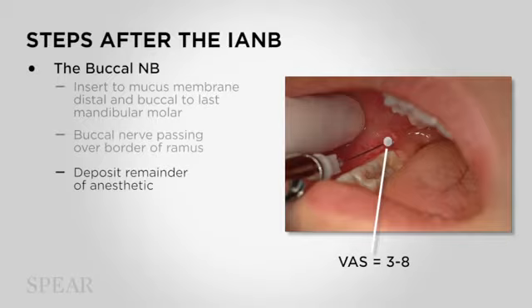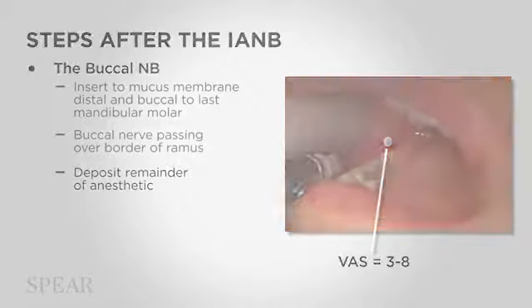And the problem with this injection is the moment your needle enters into the soft tissue, you're on periosteum, and periosteum is very sensitive. You can put topical on to make the needle puncture painless, but there's really no magic answer to making this injection painless, because if you start injecting local anesthetic as soon as you enter the soft tissue, it leaks back out into the patient's mouth. And I've never seen a patient who said they really love the taste of anesthetics. They are a very bitter tasting local drug. So you need to give this injection if you need soft tissue anesthesia distal to the mental foramen.